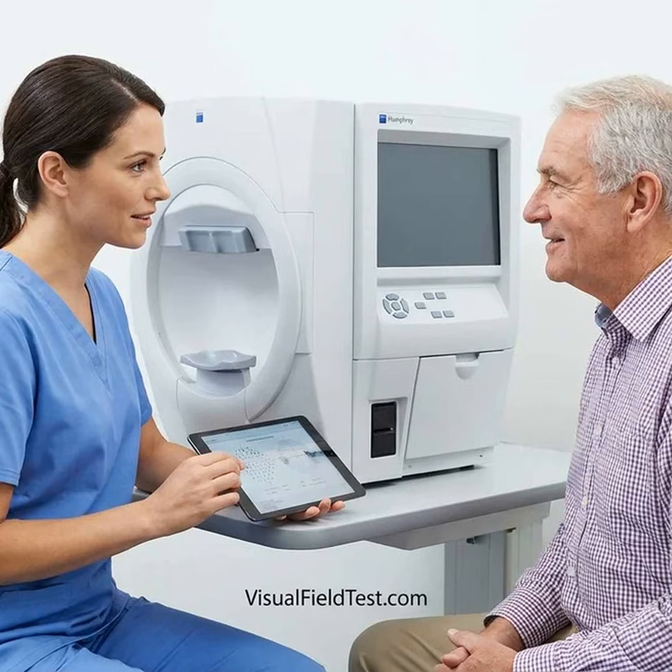In-clinic tutoring versus application-based home modules. What in-clinic tutoring does best? In-clinic tutoring is strongest when the patient is taking the test for the first time. The patient has previously produced unreliable results. There is significant anxiety. The patient has drooping eyelids, neck or shoulder problems, tremor, hearing difficulty, or cognitive impairment. The test is being used for diagnosis, disability assessment, or an important treatment decision.